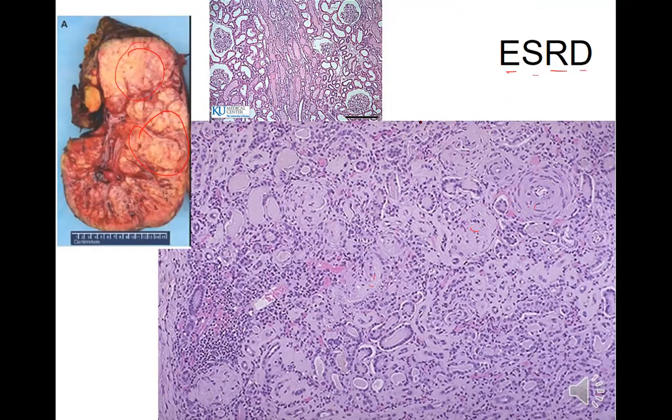So now we have to decide whether there's going to be a transplant or, especially if dialysis is not working. Because medication is not going to help here. So hopefully this is just one kidney and you can do a transplant. If not, you're going to be on dialysis forever if you're in end-stage renal disease. So of course, this is too late in the post-mortem with the kidneys showing, unless they took this kidney out and transplanted it. So end-stage renal disease, massive amounts of glomerulosclerosis and glomerulonephritis. And what's worse, you can get more chronic pyelonephritis.